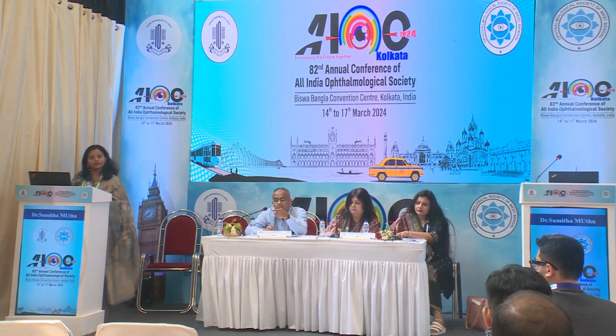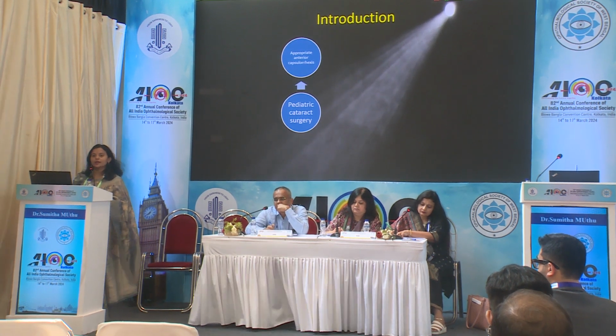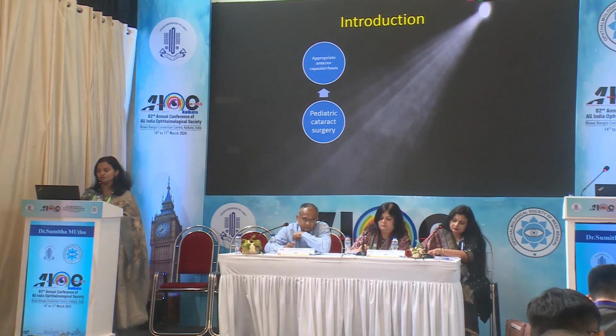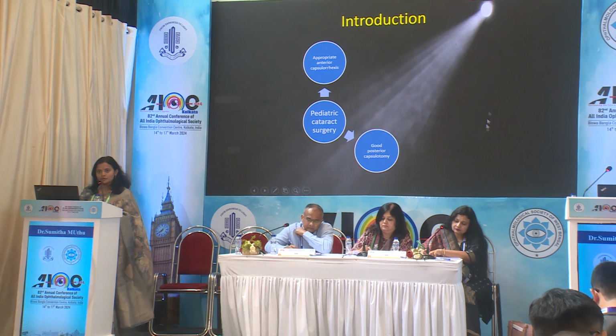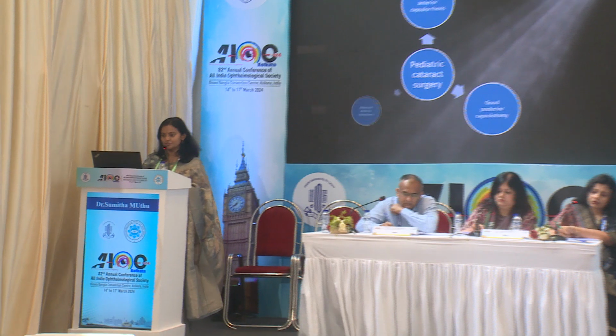We know that pediatric cataract surgery poses several challenges. An appropriate anterior capsular rhexis becomes a challenge, especially because of the elastic capsule and the need to use a rhexis forceps, which residents are not used to. A good posterior capsulotomy is required for this. A good visualization of the posterior capsule is essential, and adequate anterior vitrectomy is required. Again, visualizing the transparent strands becomes a challenge here. So proper visualization becomes utmost essential in completing each of these steps.